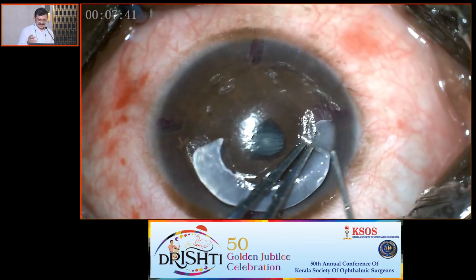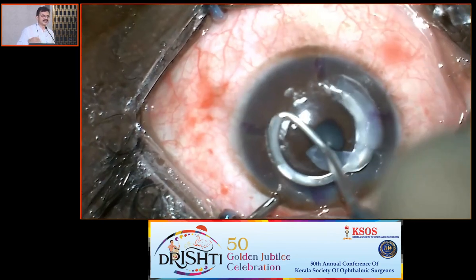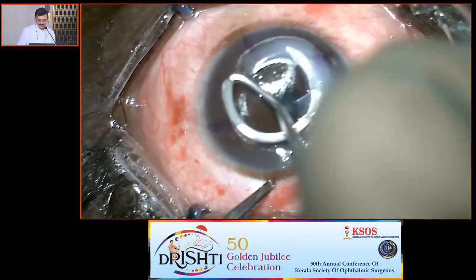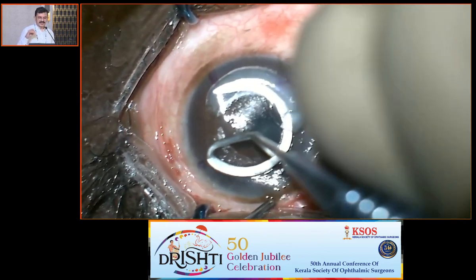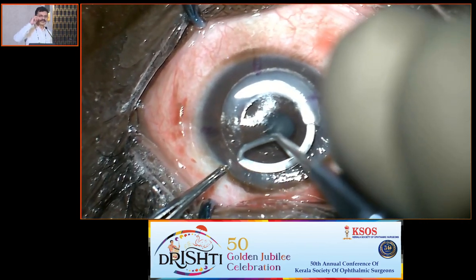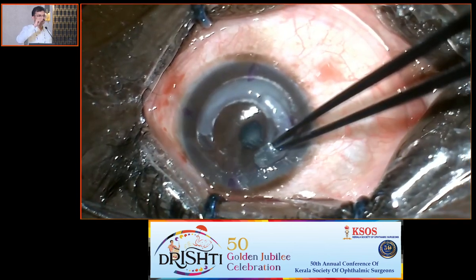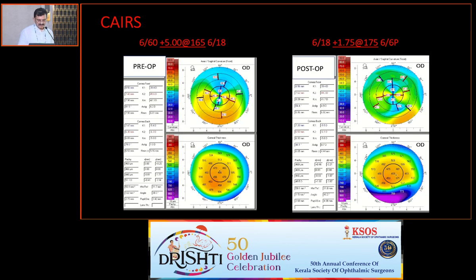The inserting technique is still not standardized. The more you keep on using that, you learn better. Each surgeon will develop their own. Right now I am using an inserter, and some people dry it for half an hour. My fellow, my registrar, Dr. Vandana, dries it half an hour. It becomes almost like a PMMA. Then she just pushes that. Then inserts. It works very well, and the results are very good in most of the cases.